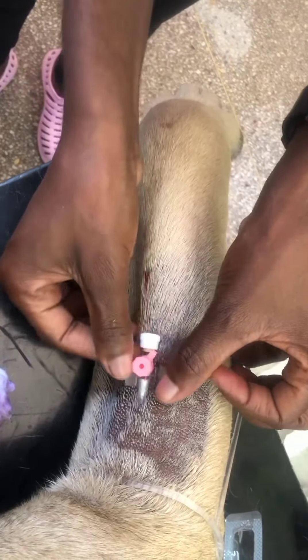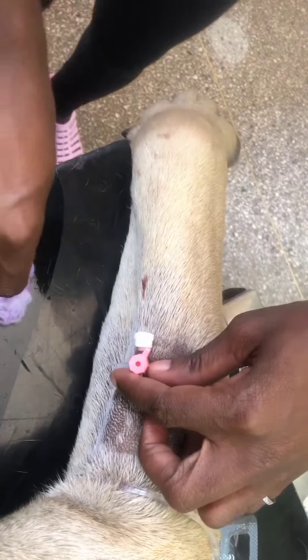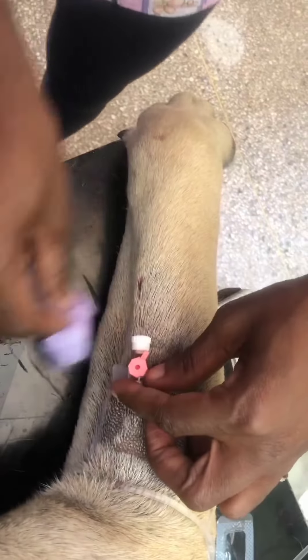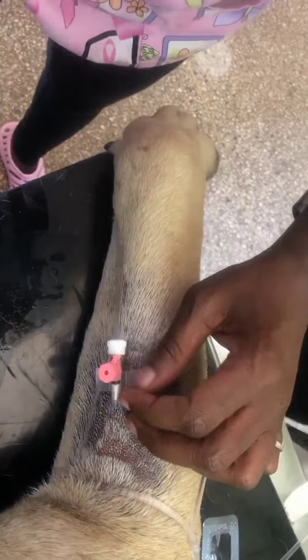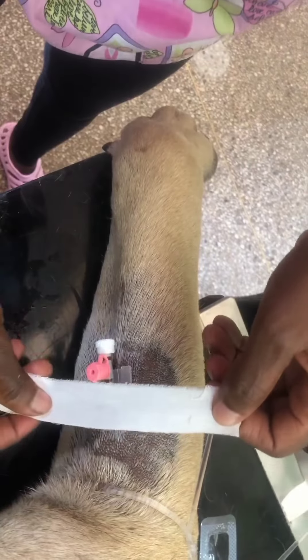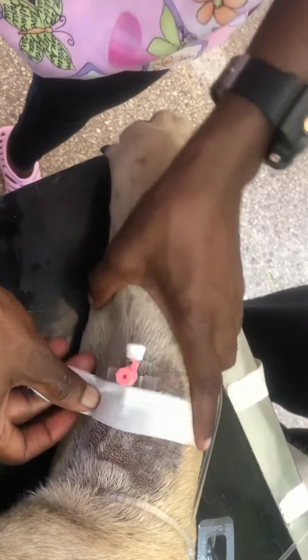As you can see, this dog is quite big, and it's not all the time that you see the vein, so it's very, very important that you know your anatomy and know where the cephalic vein is. Please don't ask me why I'm not wearing gloves. Anatomy is very important because the veins might not always be obvious, but you need to know where they run.